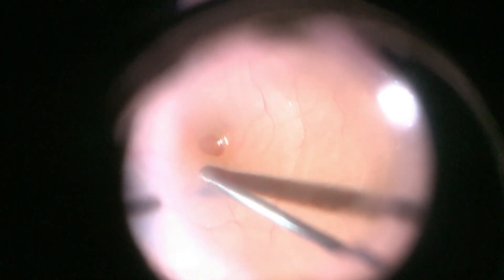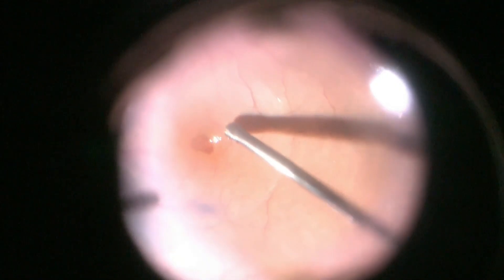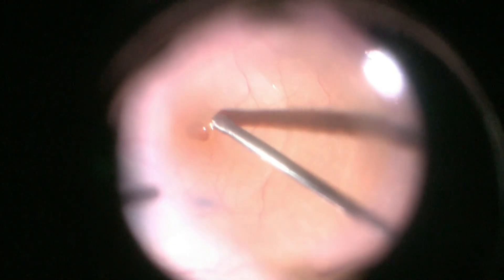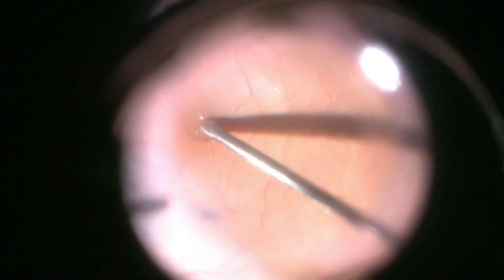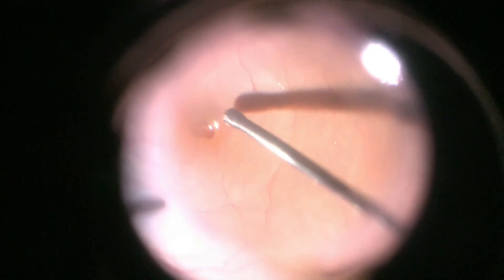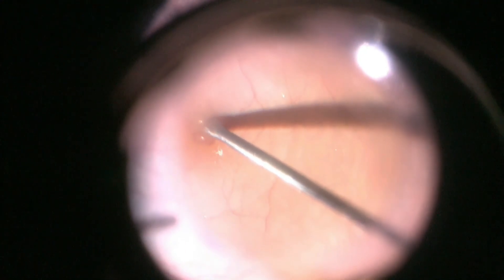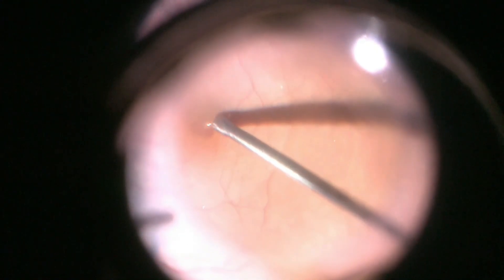This being a large hole, a massager was used to relax the margins of the hole. Relaxing retinectomy was done to relieve the residual traction present near the break.